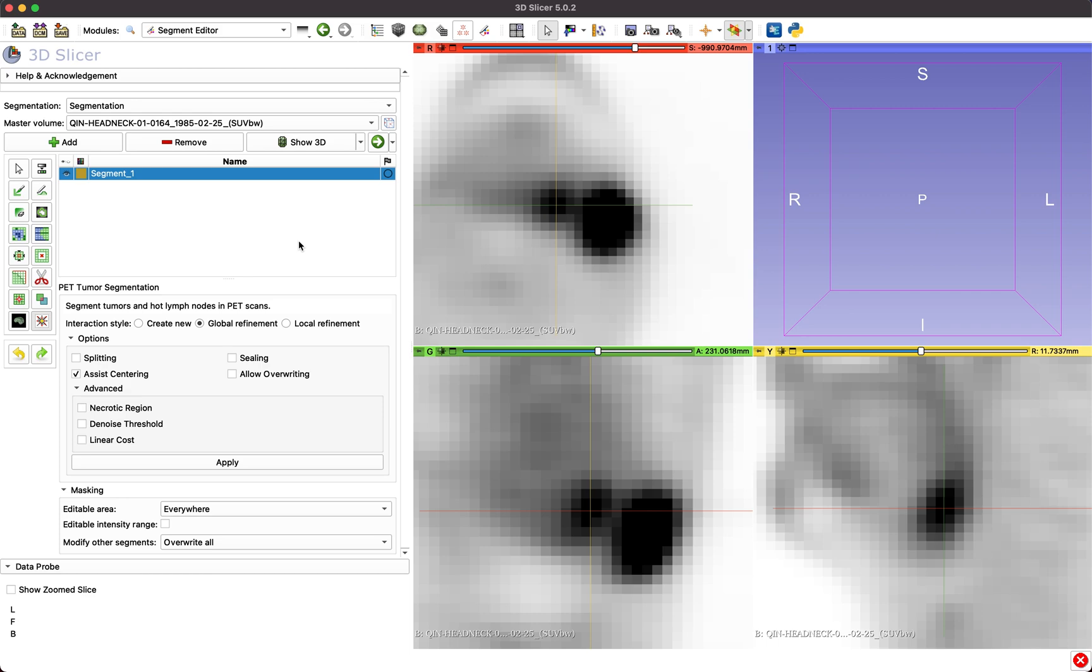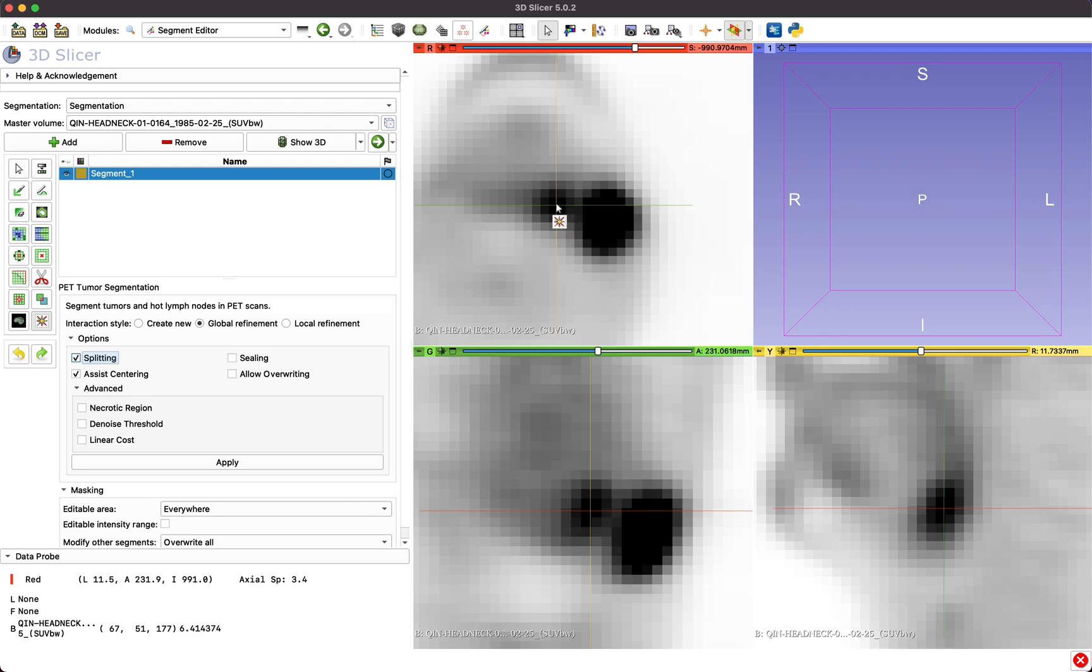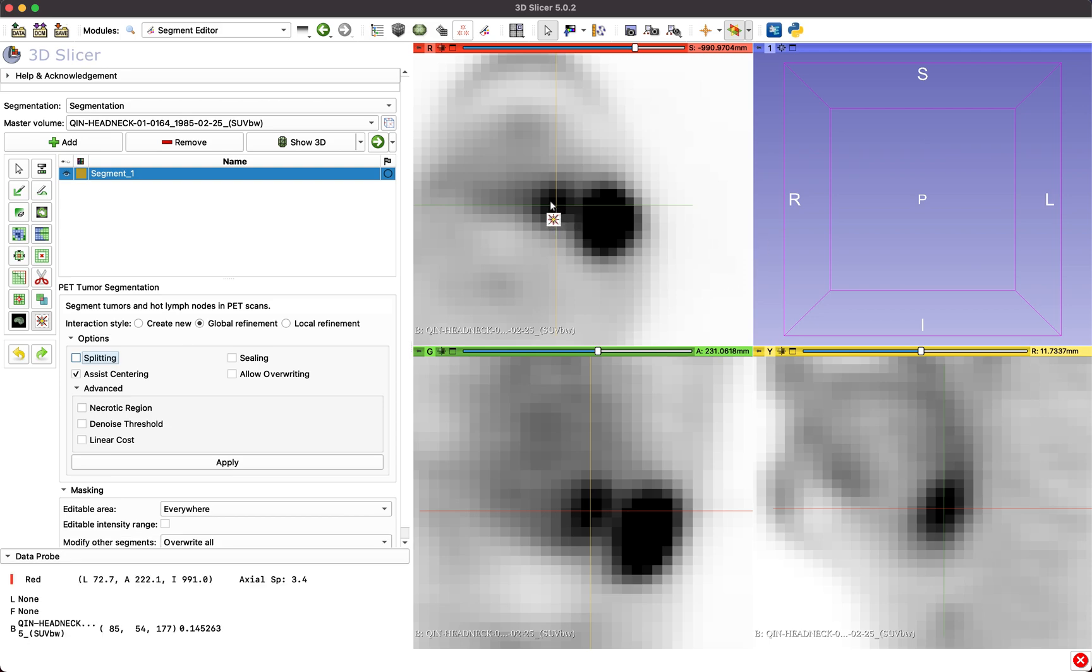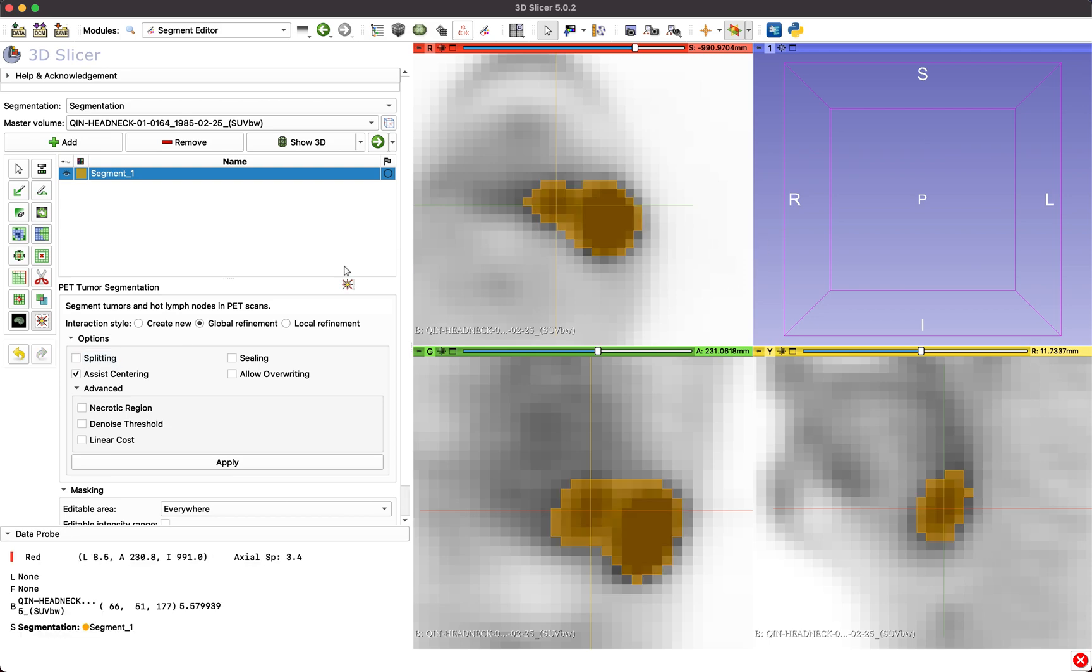The tool also offers different options providing additional information to the algorithm. You can specify these options before starting the segmentation or apply them after initial segmentation by clicking the Apply button.